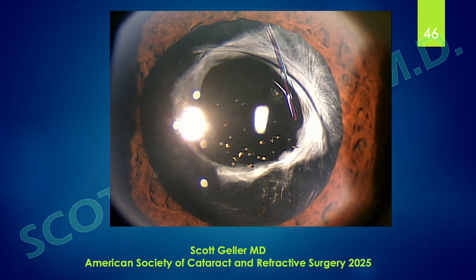So I would call this, what you're looking at here, a mistake. I can't judge. We weren't there seeing what was going on. Obviously, there's quite a dense membrane back there, and it required a lot of power, but there are ways of reducing the propensity towards damaging the lens.